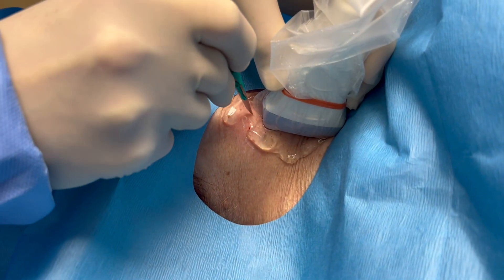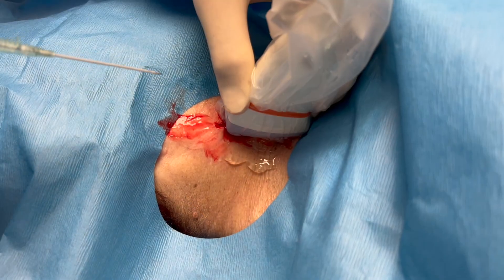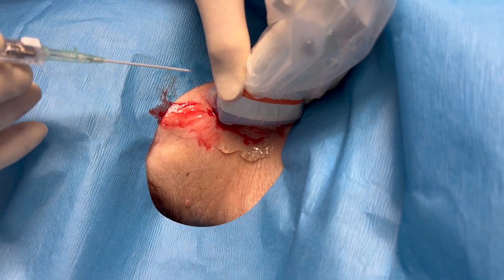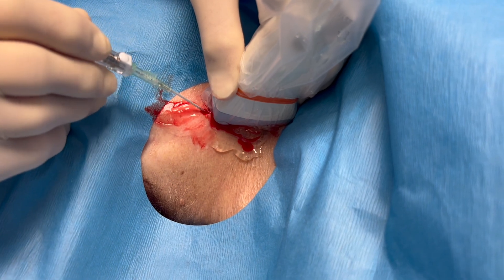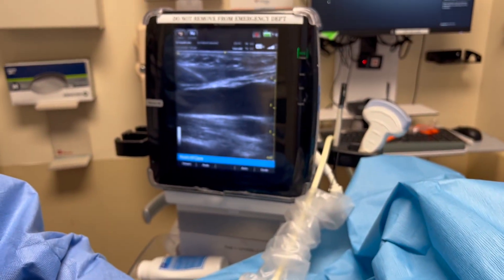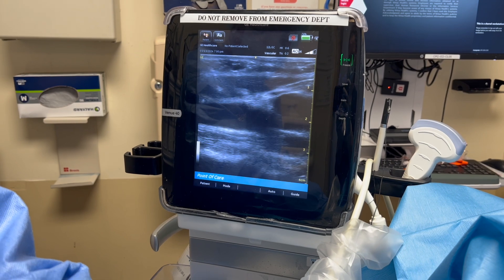I prefer to make an incision before I place my needle, but you can do it the other way around — a lot of people like to place the needle first. Placing the needle through the incision works for me. I tend to use a catheter over the needle, not just a plain needle. This way I can slide the catheter into the vein and not have to hold the needle in place. I also like to do it longitudinally so I can see the catheter and the needle enter the vein.